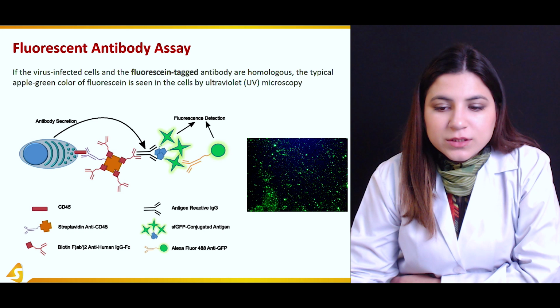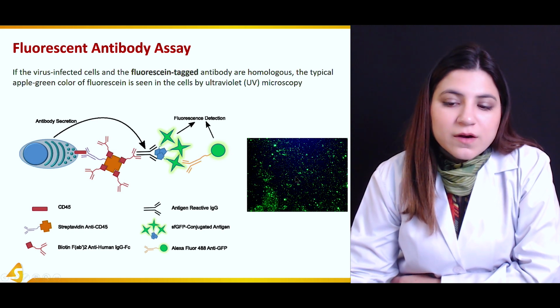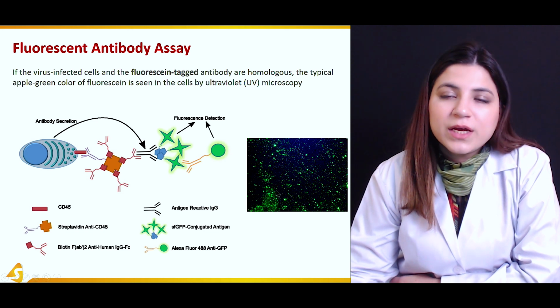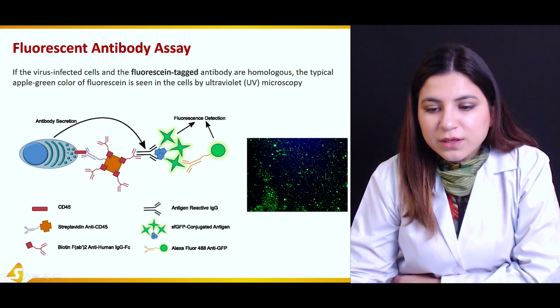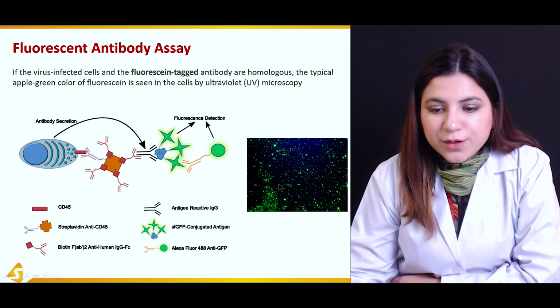by viruses. So only those cells that contain the virus or that are infected by virus will be able to bind the tagged antibody, and the fluorescence can be seen only after the antibody is bound to that particular cell. As you can see in this figure, all those green signals show the infection of virus cells, and the places where you cannot see any signal are black.